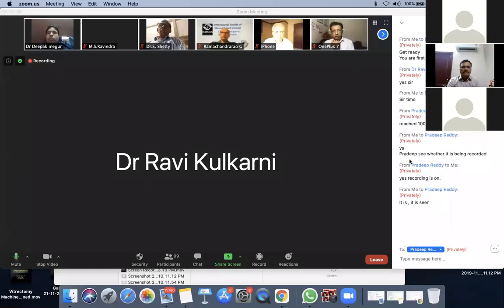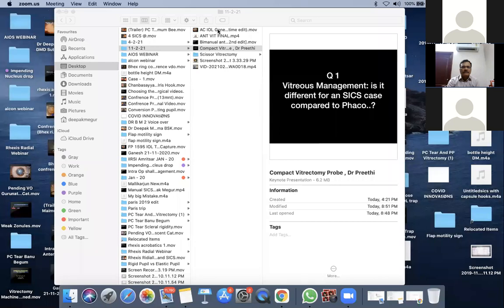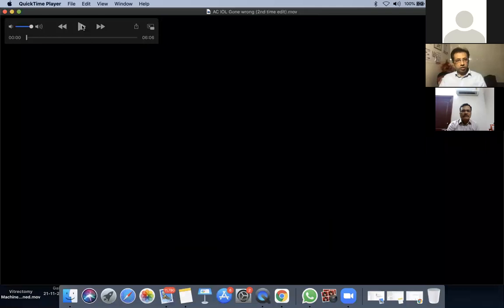We are talking about all anti-vitrectomy. I just want to go and show why it is so essential. Please let me know whether the voiceover is clear or not.